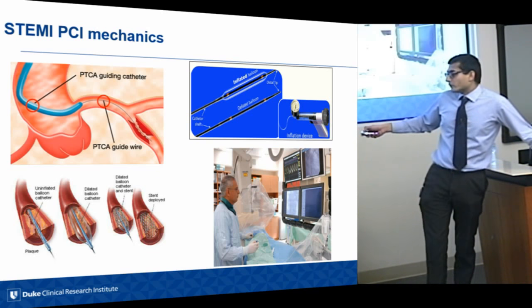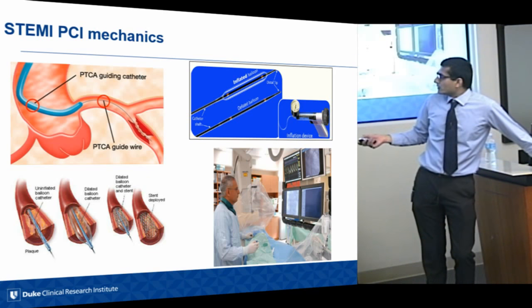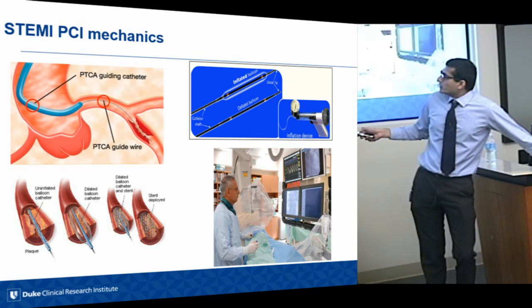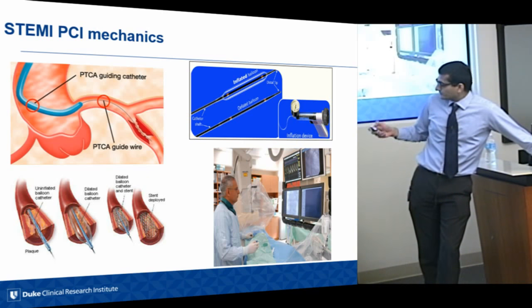And we obviously work from outside. Essentially, it's like a video game, where you're able to see on a screen what you're doing. I mean, everything is radio opaque, so you're able to see, but essentially we're working from outside. It's a beat-by-beat monitor of blood pressure, and so when the patient starts to crash, you're able to tell fairly quickly.